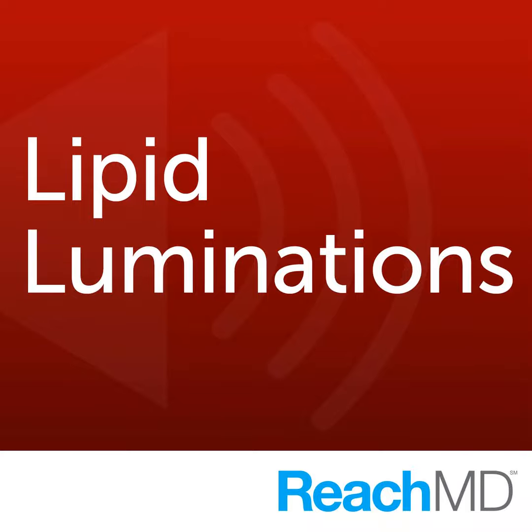And I guess the one point I wanted to make about the appropriateness criteria was they did mention coronary calcium score. So if someone has a very high coronary calcium score, then carotid IMT is not going to add anything. But if you take a patient who has a low coronary calcium score, like 0 or less than 10, again, carotid IMT isn't going to add anything if their Framingham risk assessment is very low. But if their Framingham risk is high, but yet they have a coronary calcium score of 0, that would be a particular group where it would be appropriate to use carotid IMT.